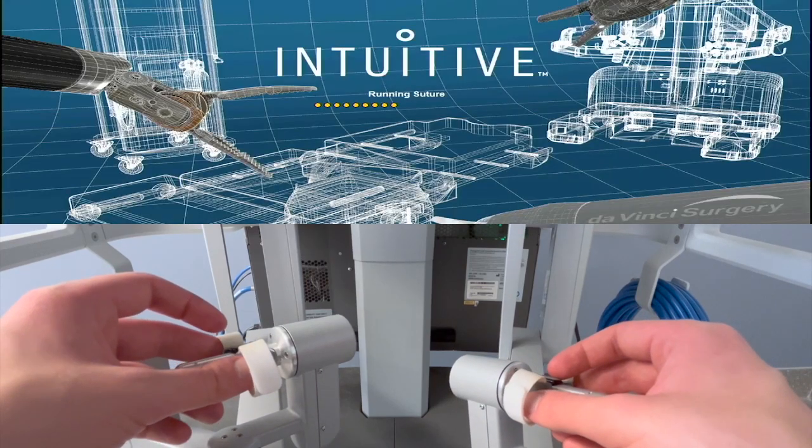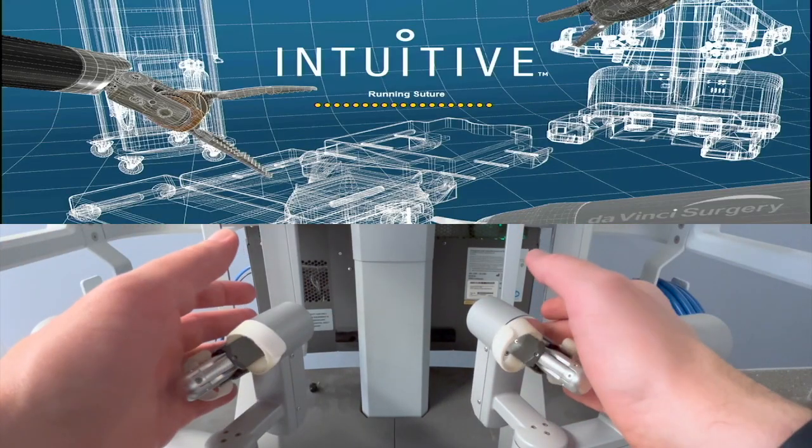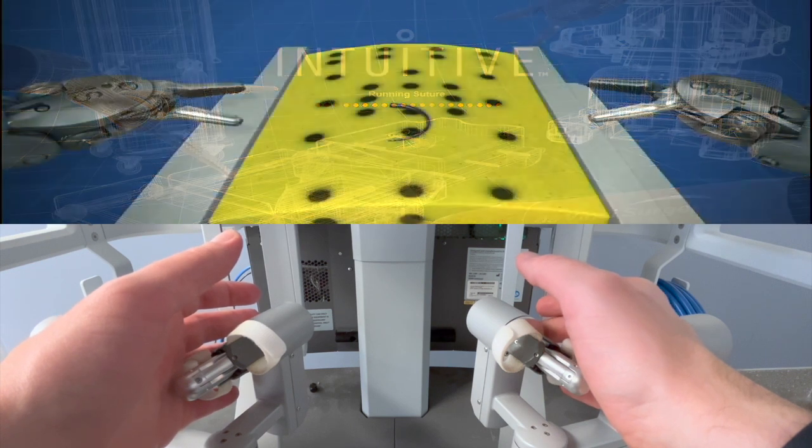Hello everyone, this is another tutorial on the running suture exercise on the robot.